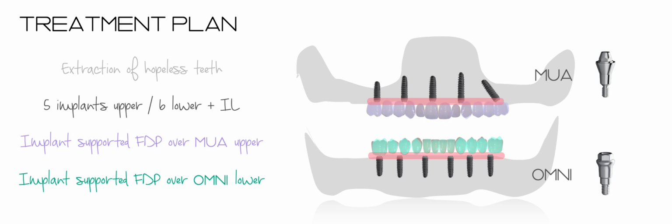On the mandible, the patient exhibits less soft tissue thickness, so that's why we selected the OMNI abutment as prosthetic components. The OMNIs have a smaller diameter than the multi-units, 4 mm versus 5 mm of the multi-unit abutments. Also, it's important to mention that prior to implant placement, a decontamination of the deep pockets was carried out.